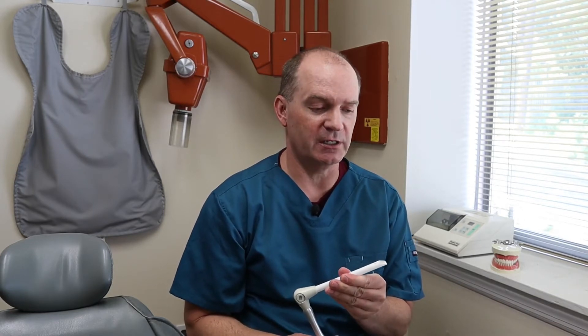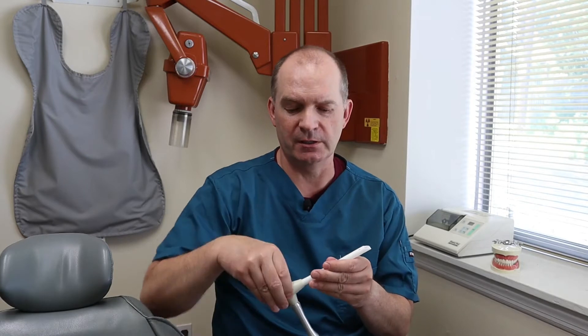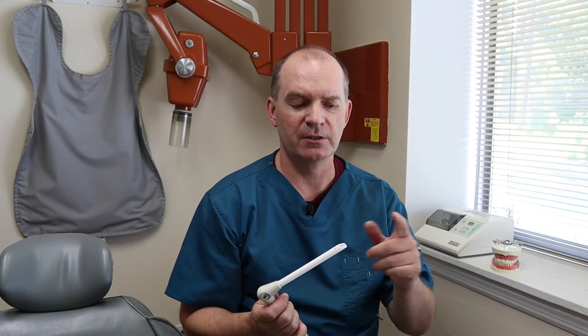The second one is called the high volume suction, also the high speed suction. This one's a little bit different. This one is used when you're getting a tooth drilled on, getting it worked on. In those situations, the dentist's drill is spitting out a lot of water, you're making a lot of saliva, and the dentist or the assistant is rinsing the tooth off with the water spray. So this one is a lot stronger — you can hear the difference. This one can remove a lot of water really, really quickly.